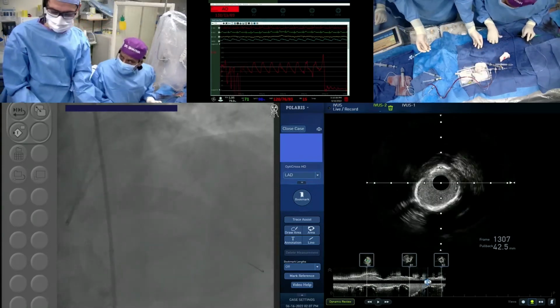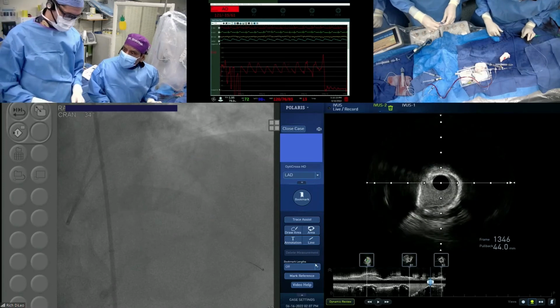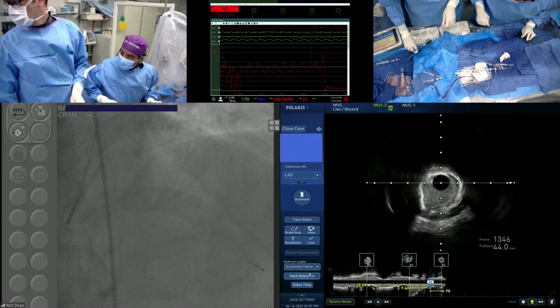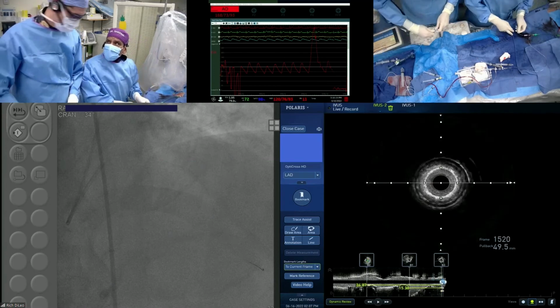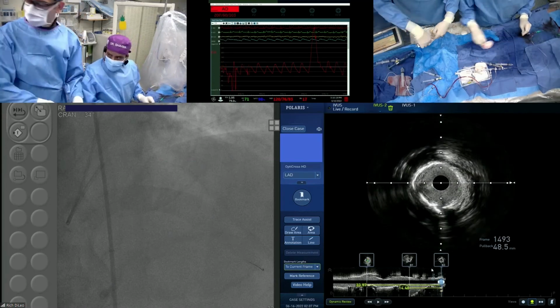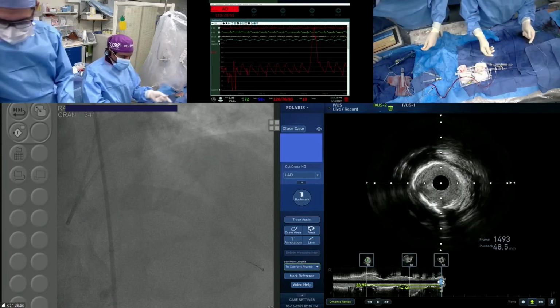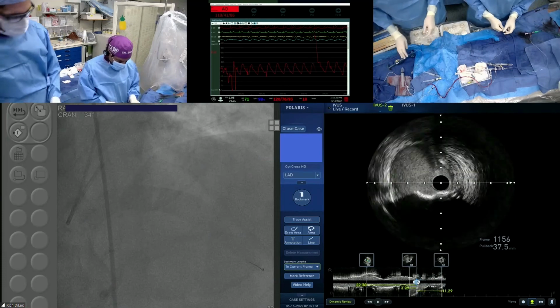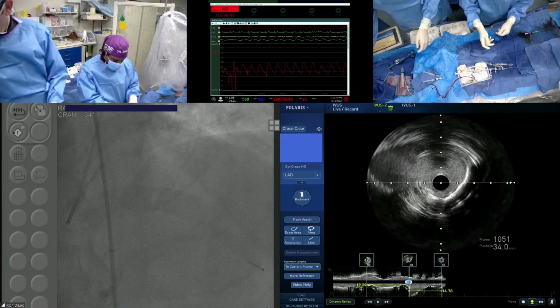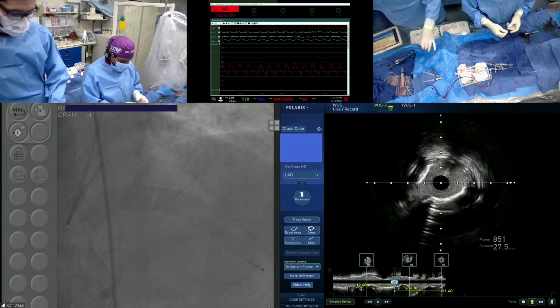Dr. Duvuri brings up another possibility, the ROTA-shock approach. Instead of the ROTA cut, you do the rotablation and then a shock wave. That's another approach, I suppose, before stenting. Actually, that's what I would personally favor, because I know you're going to create deep cuts in the calcium with lithotripsy at this point, to improve the compliance, right?